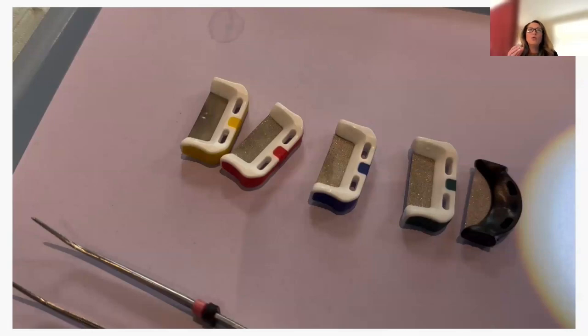And for those of us that have seen people or have had aligners ourselves, we know that when it's new, and then if you have the attachments on it, it's even harder to take off. But there are little tools you can get, different names for different tools. They remind me of a crochet hook that they can use to get back there and pry them off to begin with, so they get used to it.